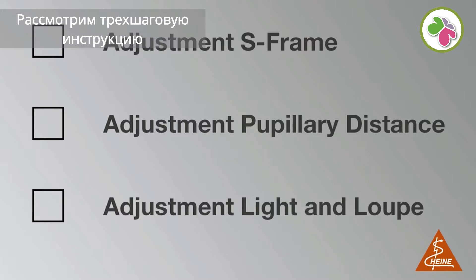Now we'll go through the perfect setup in three steps. First: adjustment of the S-frame. Second: adjustment of the pupillary distance. Third: adjustment of light and loop.